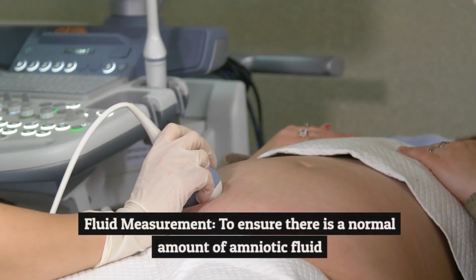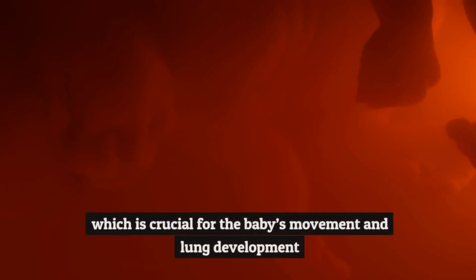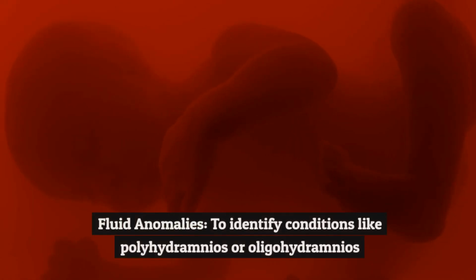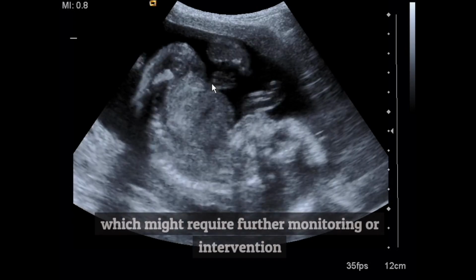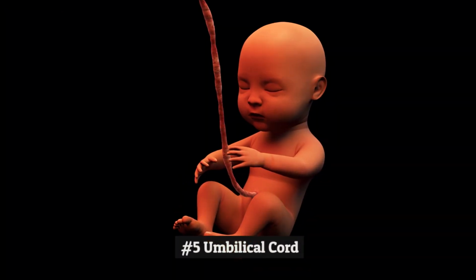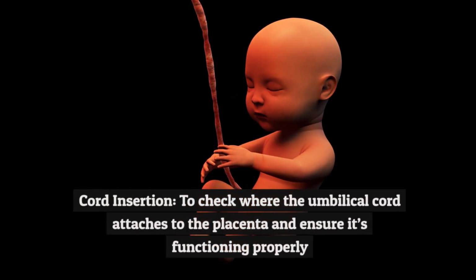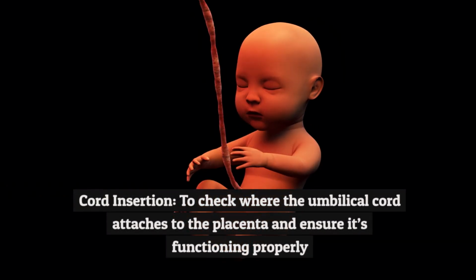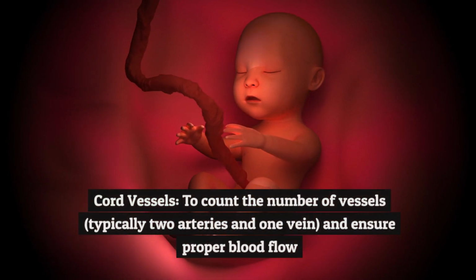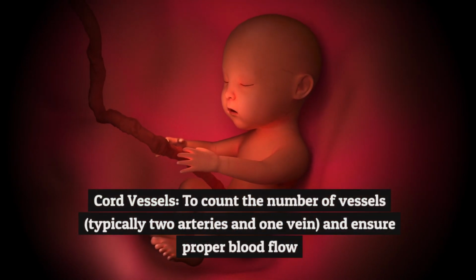Fluid measurement, to ensure there is a normal amount of amniotic fluid, which is crucial for the baby's movement and lung development. Fluid anomalies, to identify conditions like polyhydramnios or oligohydramnios, which might require further monitoring or intervention. Number 5, umbilical cord. Cord insertion, to check where the umbilical cord attaches to the placenta and ensure it's functioning properly. Cord vessels, to count the number of vessels, typically 2 arteries and 1 vein, and ensure proper blood flow.